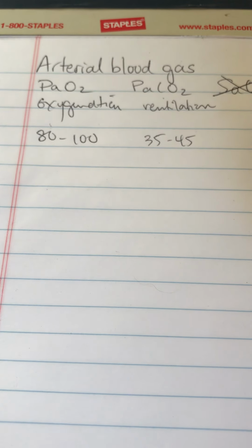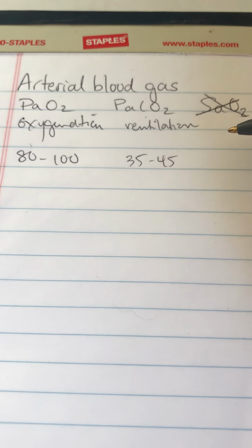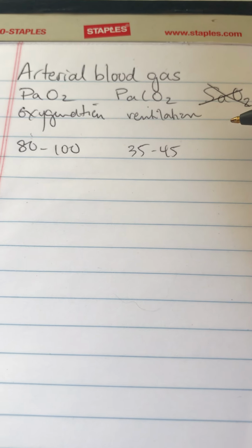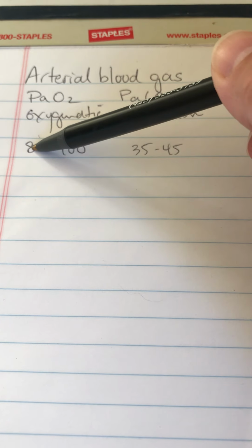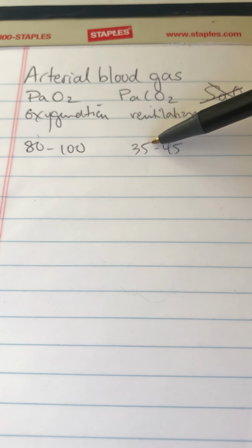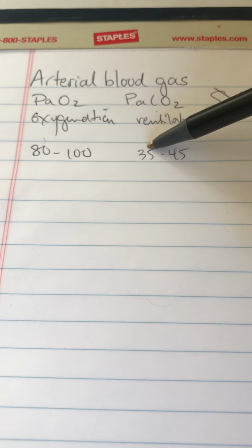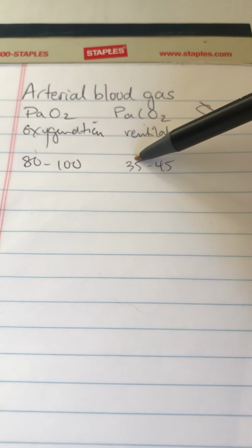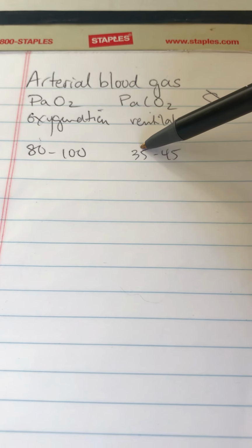And this is generally accepted by the critical care college regardless of what your machine says, so forget the ISTAT normals. This is what we're talking about. The lowest oxygen I want to accept is 80, and the lowest ventilation I want to accept is 35. That's what's really important when we're examining an arterial blood gas to see if we need oxygen. That's the only question we're going to address today.